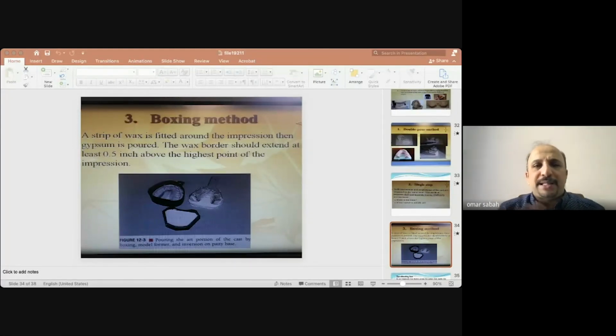1 ستيبس راح استخلط الماتيريال، بس دير بالي انا ديورينج ميكسينج عندي بلاستر عندي ستون، فالستون لازم يصيروا بدايه سيت، يلا اجيب البلاستر واعمل له بيس. والا الماي اللي البلاستر راح يجي ياخذ الماي كمين من الستون، وممكن الستون راح يصير عندك في السطح رف اوكي خشن، لانه راح ينفقد الوتر منه، راح يسحبه ابو البلاستر، او راح ياثر عندي على ايش؟ على الميكسينج.